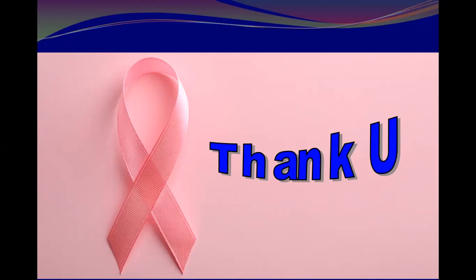You will put the skin and nipple areola in the narrower zone of the transducer, the narrower field or elevation zone focus. So this is the narrowest part, the sharpest image.